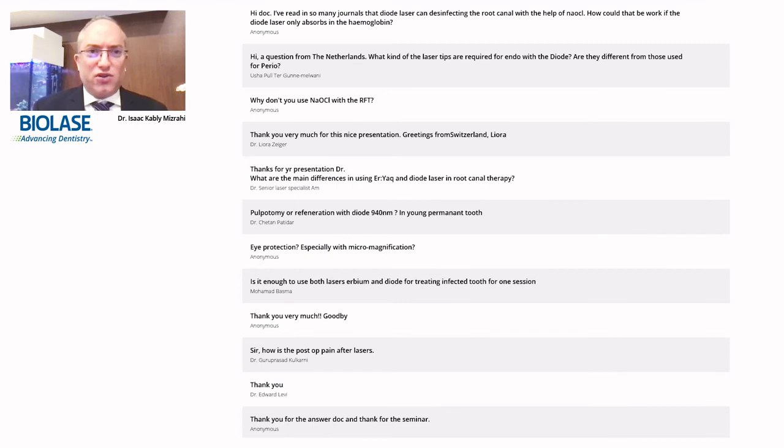But to answer the question, I wouldn't use an E2 for perio. I would go more for an E4, for example, or an E3 for perio, and use an E2 inside the root canals.